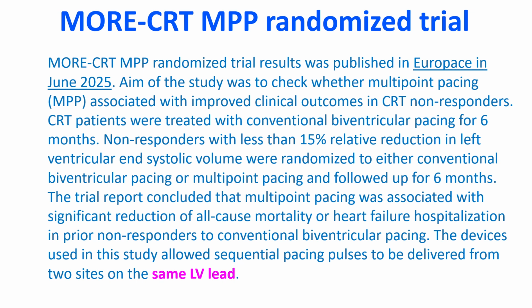More CRT MPP randomized trial results were published in Europace in June 2025. Aim of the study was to check whether multi-point pacing, that is MPP, was associated with improved clinical outcomes in CRT non-responders. CRT patients were treated with conventional biventricular pacing for 6 months.